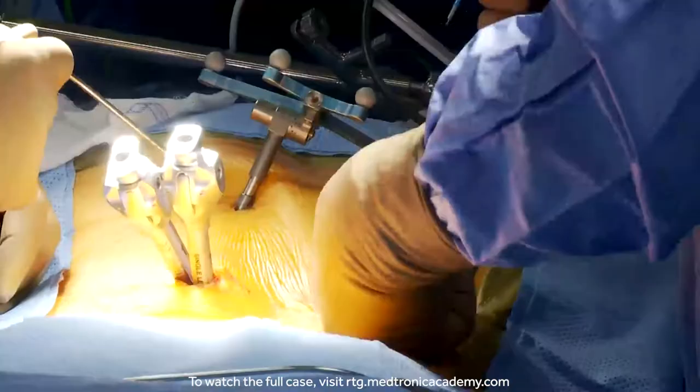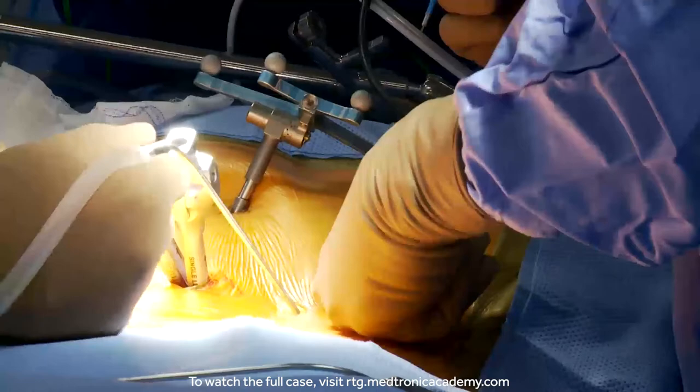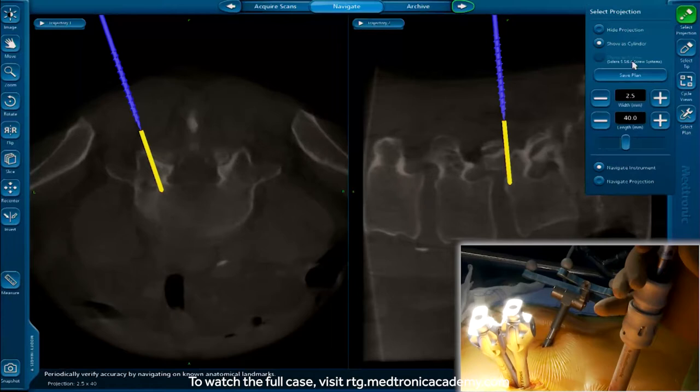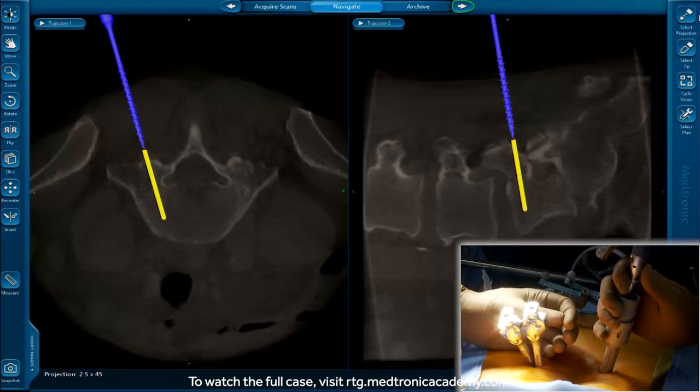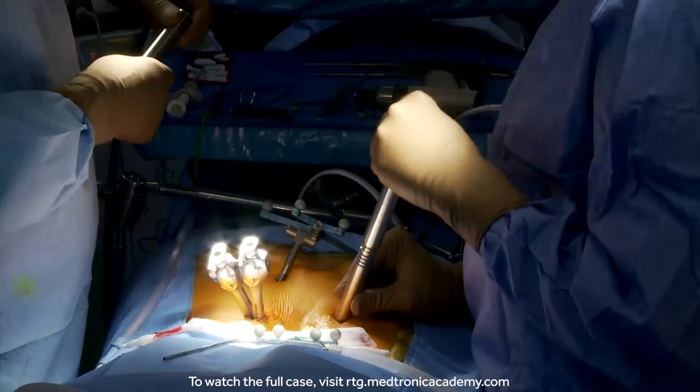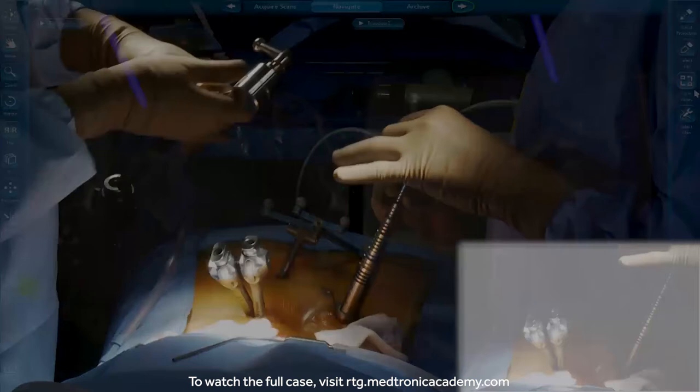that hole. I'm feeling the sacrum where the entry point's gonna be, and then I'm feeling the transverse process of L5. So at this point, we're gonna make our pedicle entry points for after our decompression has been completed. So we're just sequentially dilating down through that tract and pushing the muscle away. What's nice about the navigation part of this is I can put this back on my probe and make sure I really like my angle and trajectory.